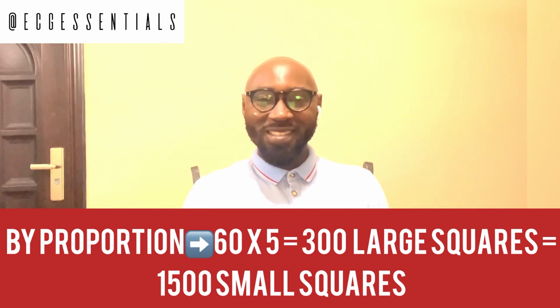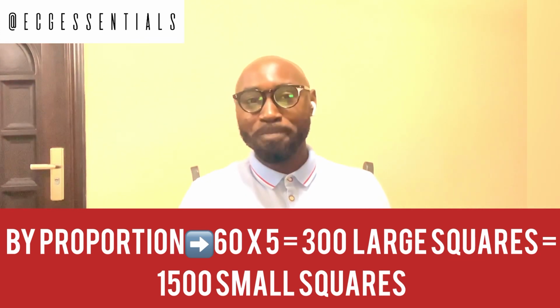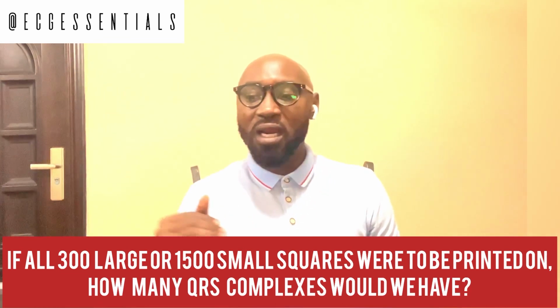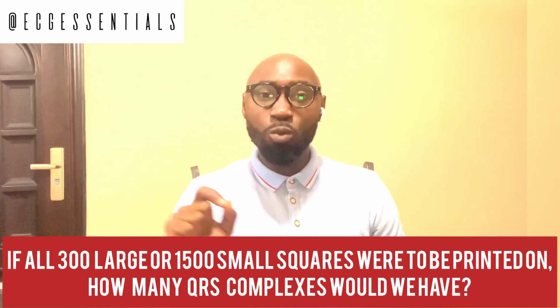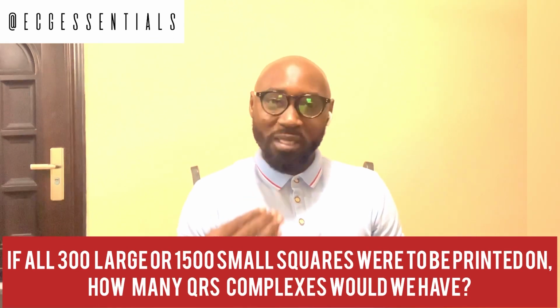In doing this, the simple question that we are asking and actually answering is that if we were to allow the ECG paper to print on all these 300 large boxes that we expect to be printed on within 1 minute, that is 60 seconds, how many QRS complexes do we expect to see?